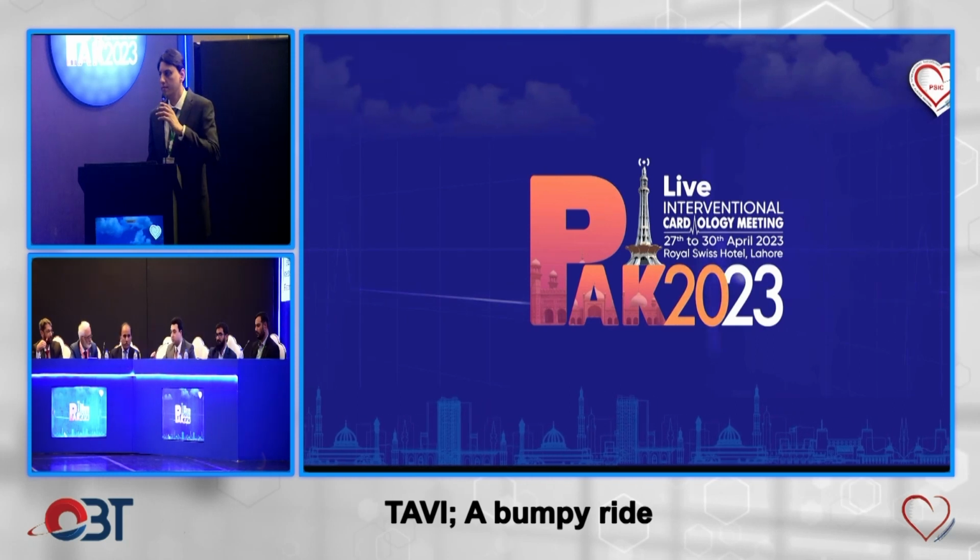I think that was a wonderful case and a wonderful demonstration. Just a question: we all know it was a case of bicuspid aortic valve with a concomitant coarctation of aorta. Considering the morphology of the valve, it's always going to be more ellipsoid as opposed to circular. So is there any consideration given in terms of valve selection and sizing up? And what are the recommendations?